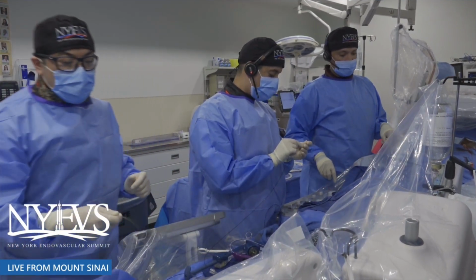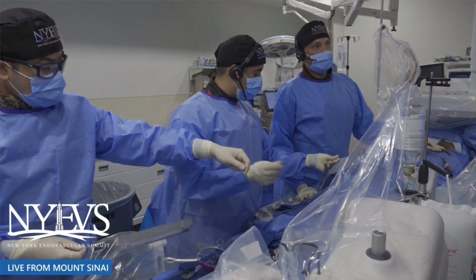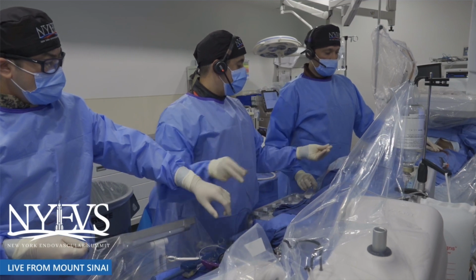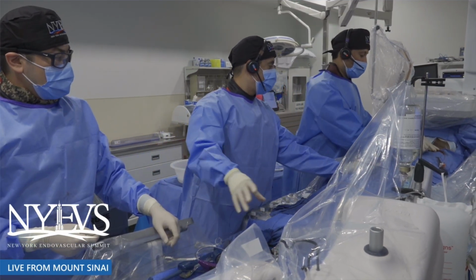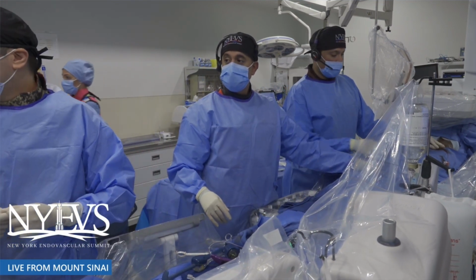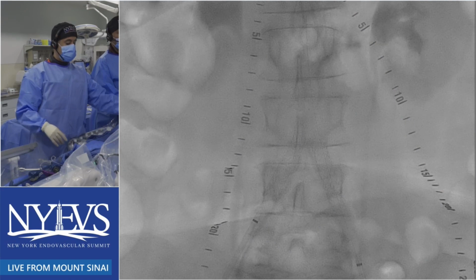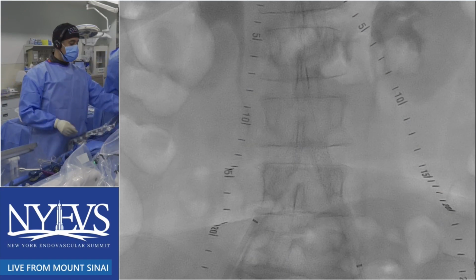If you had axial imaging, you probably could be a little more confident. I have a couple of times had a dissection. It doesn't extend proximally, but you can dissect that distal aorta some when you do that. So I'm not going for a massive, and that's why I'm not taking the size of those up further. I'm not putting 2 10s in there with 8 millimeter balloons.